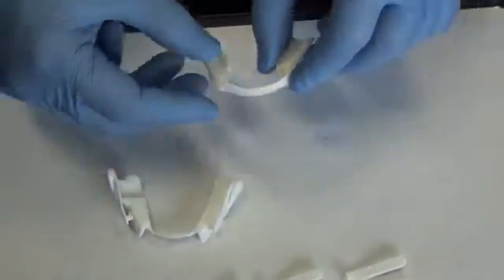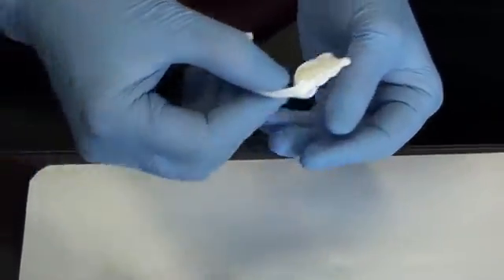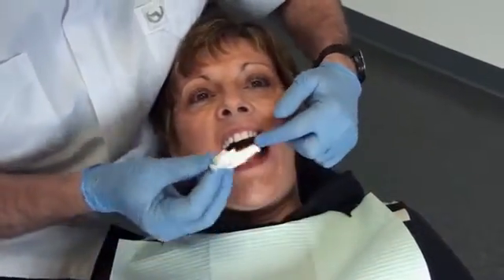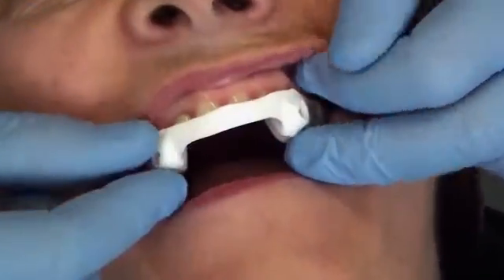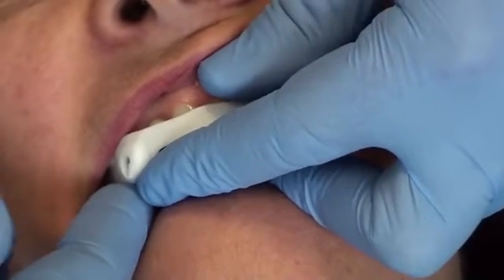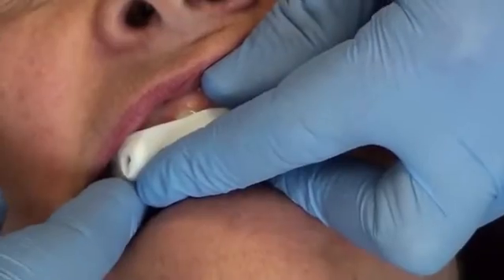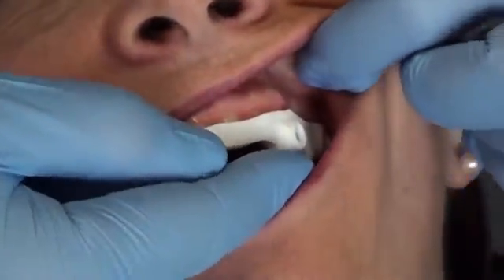I will start by inserting the upper part. It can be moistened with water to facilitate insertion. We check the positioning by placing this part at the canine tooth level — these holes face the canine teeth. We try to press on the shell on the parts on the posterior teeth. If we feel there is a light resistance and the component fits well, it is in good condition.